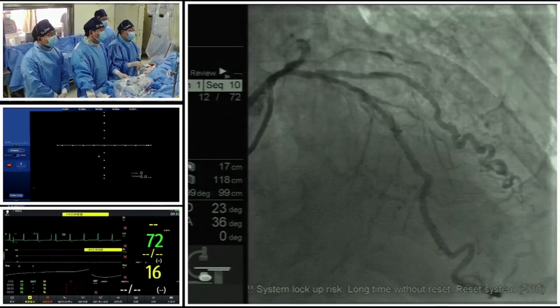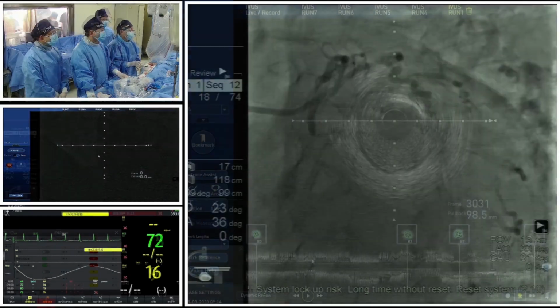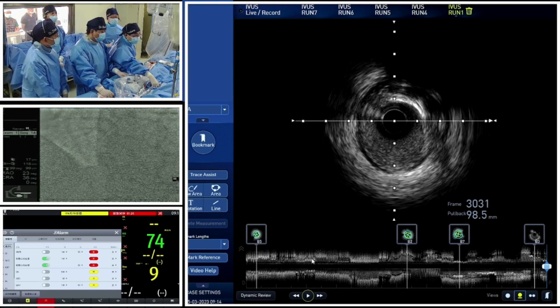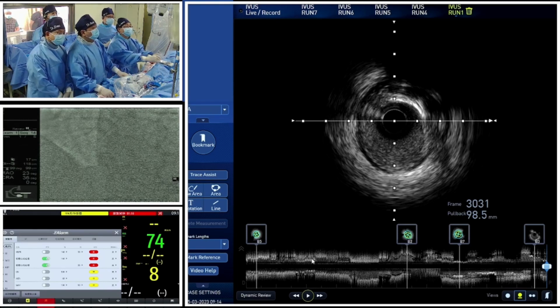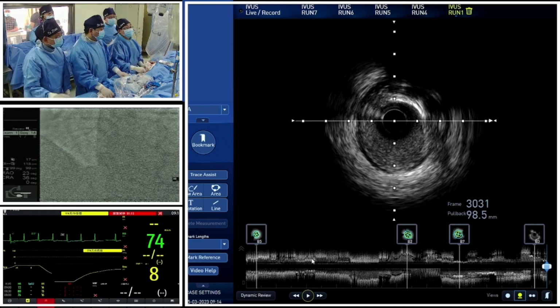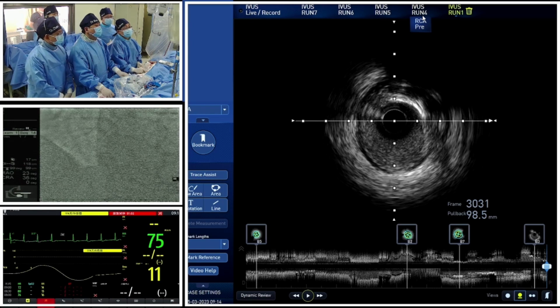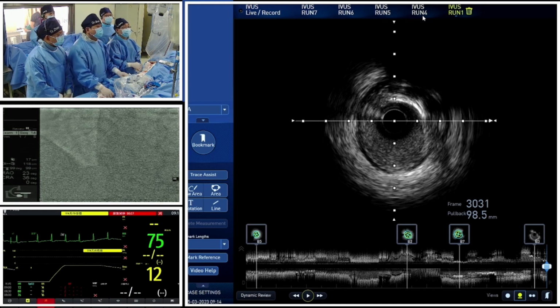Dr. Gong, from the angio, I think we can see there's some calcification in the proximal RCA. Yeah, so from the IVUS, I think the middle and the distal parts are okay. It doesn't have a lot of calcification, but it does have some calcification in the proximal RCA. And you pre-treated the lesion with NC balloon and cutting balloon. I think the result was very good because you got the stent well expanded, and then you ran the IVUS again after the stenting. Can you show us the IVUS after PCI in the RCA?